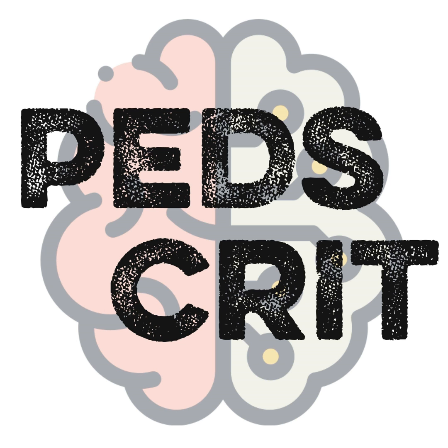It's a treatment, but if the patient is very sick, he will still be sick. Sometimes I hear, "NAVA has failed," but it's not NAVA that failed. It's that the patient is sick. NAVA was not the right tool at this moment. And so it's important to also give time for the patient to recover and improve. But it may help in certain situations.